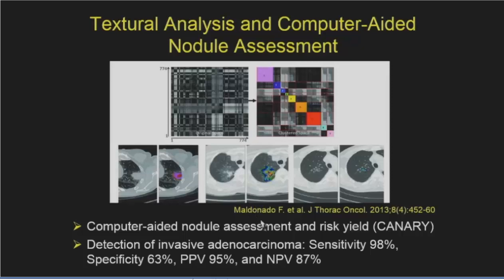This is a study from Maldonado and colleagues that used a software called Computer-Aided Nodule Assessment and Risk Yield to characterize the level of tumor invasiveness, and the software was able to have a better accuracy to detect invasiveness as compared to the visual assessment by radiologists.